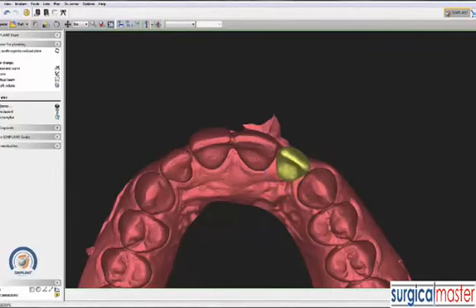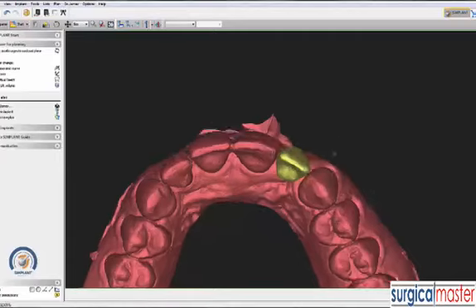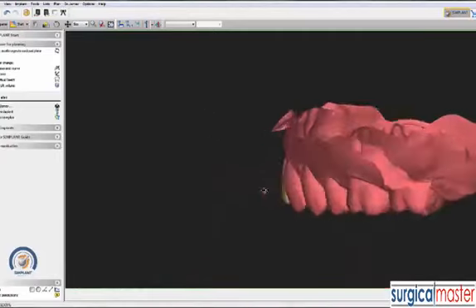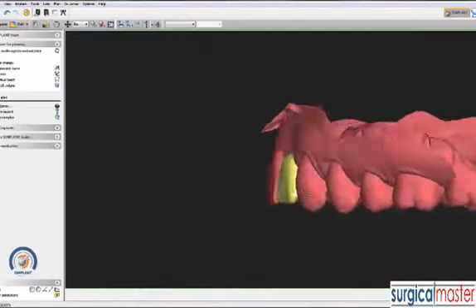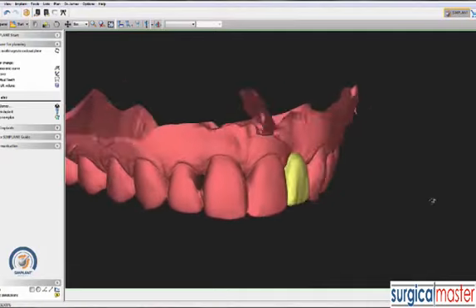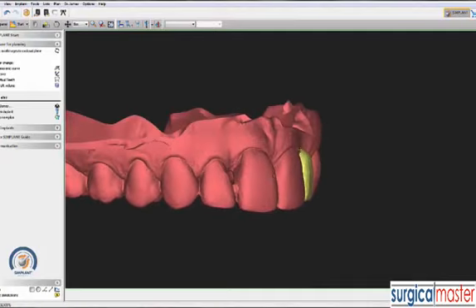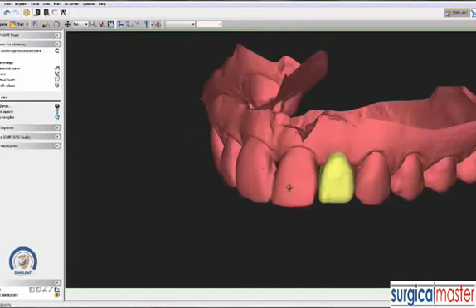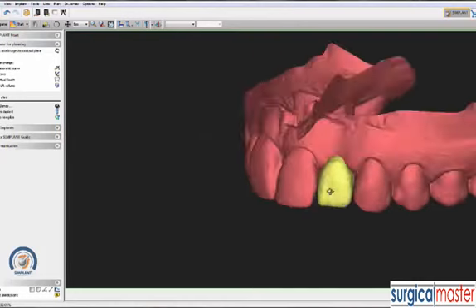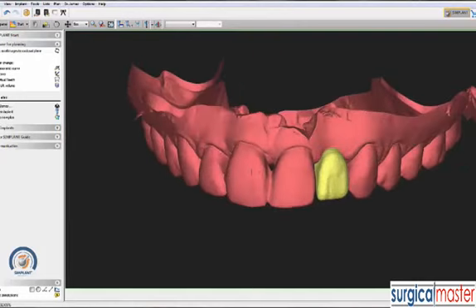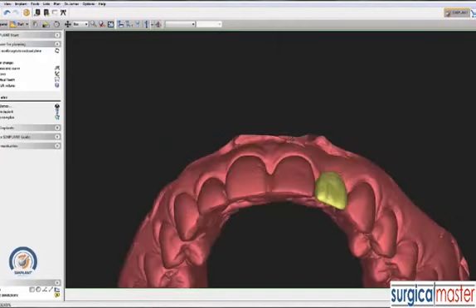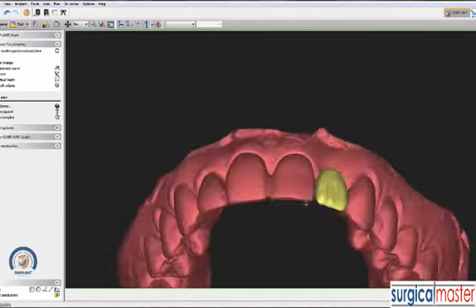I'm looking at the incisal edge to make sure it's continuous. I can also look from the buccal aspect to make sure the contour of the tooth is proper, except for the emergence profile which is currently deficient. I think this tooth is going to end up being a little bit longer than number 7, but that's quite good.